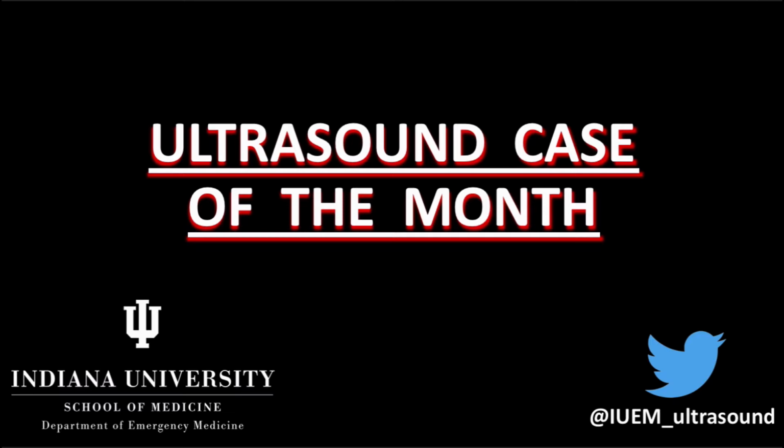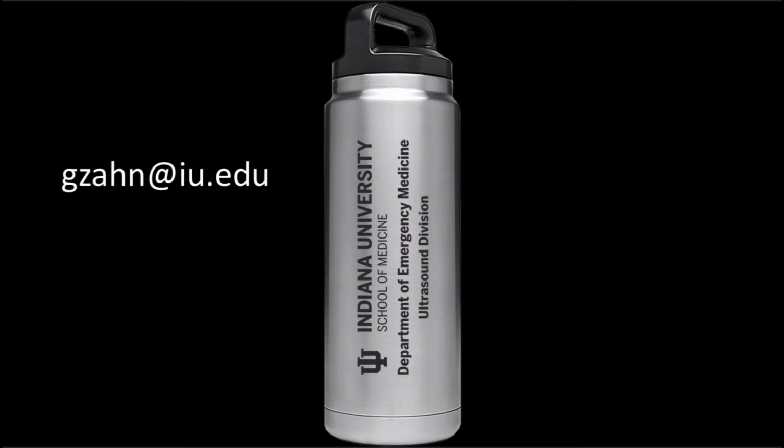If you are new to this series, the case of the month is intended to highlight an interesting case showing how bedside ultrasound can assist in the evaluation and management of our patients.